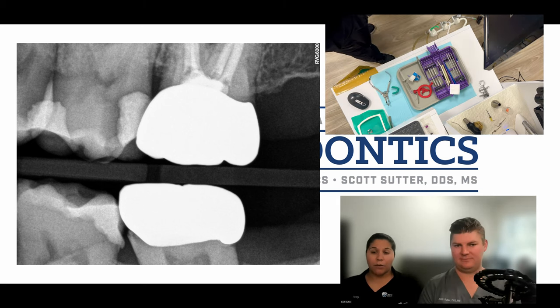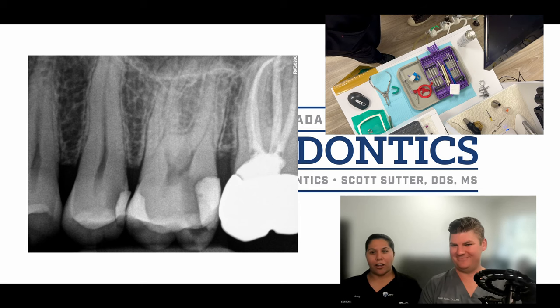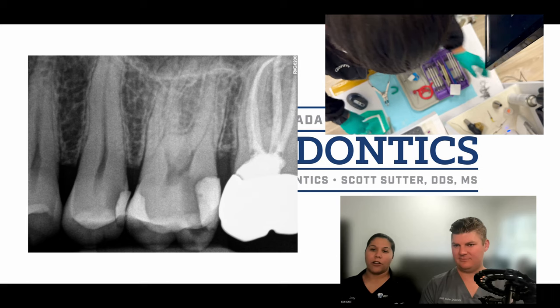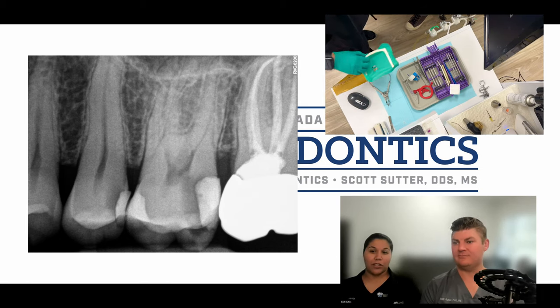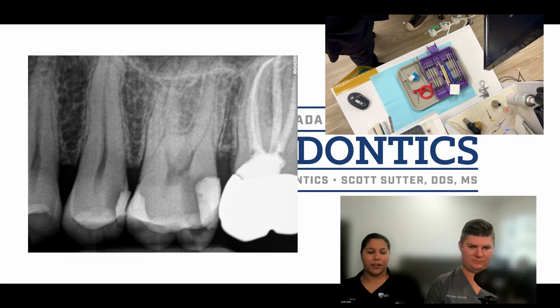At this time I've got my cotton pellet on the cotton forceps and I'm just going to spray it, shake off the excess, and gently put it on the patient's tooth to start off with and make sure that they're not feeling anything. If nothing, I'll hold it on there a little bit longer, and at this time it looks like the patient was good to go. So getting ready to hand the rubber dam to Dr. Suter, we'll get going.